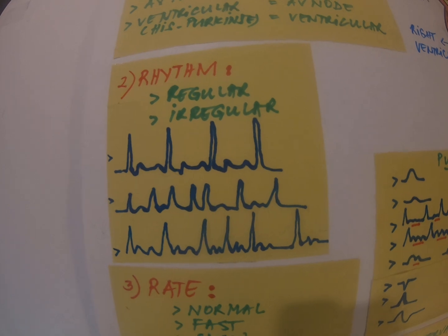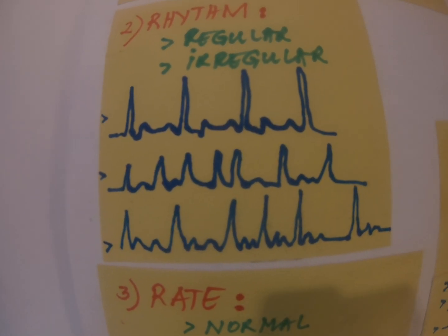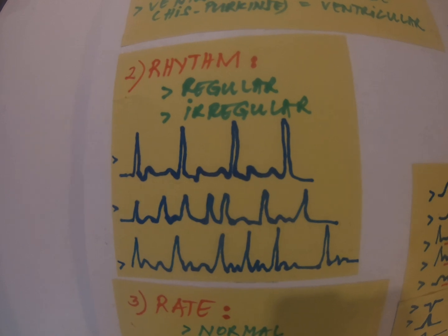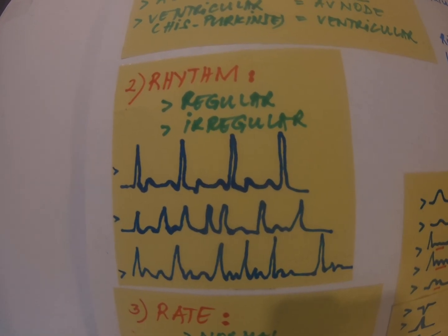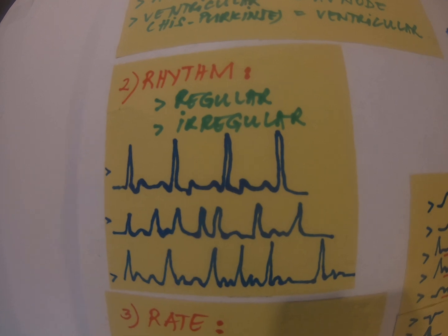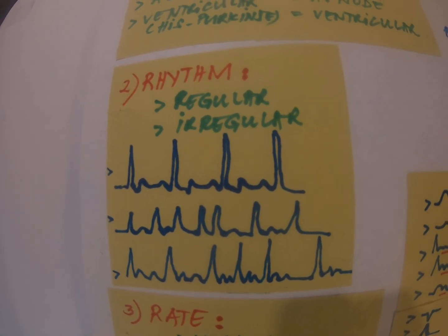There could also be flutter, and there is also the tachy-brady, right down here, or the atrial tachycardia here. Okay, so sometimes our atrial flutter can also be regular if the ratio is exact, 2:1 AV ratio. But normally it varies, and the AFib is very irregular, so they're both irregular, usually.